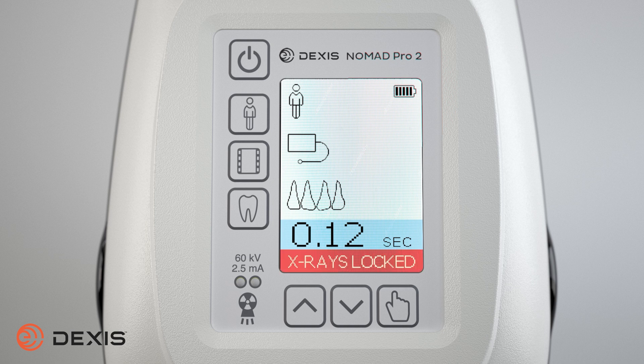With the x-rays locked, you can program the exposure settings. Note: the factory settings are intended as a starting point. When the power is turned off or the battery is removed, the time settings will revert to the most recent saved settings. By pressing the patient button, you can toggle between adult and child patient types. Notice the exposure time factor changes between adult and child to accommodate people of different sizes.